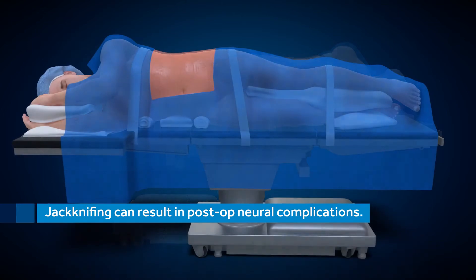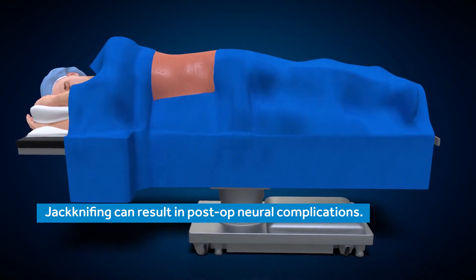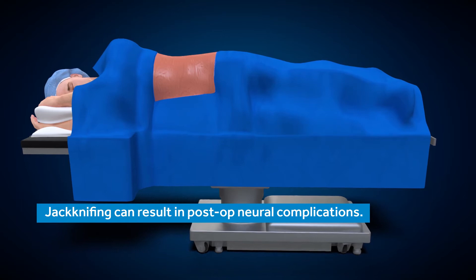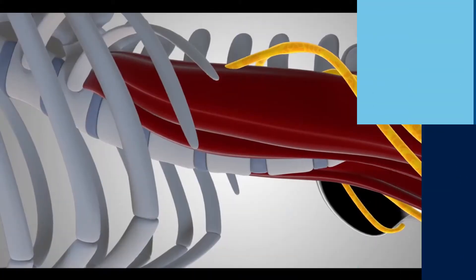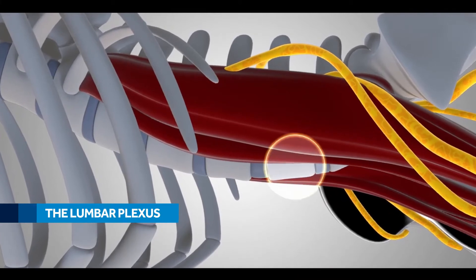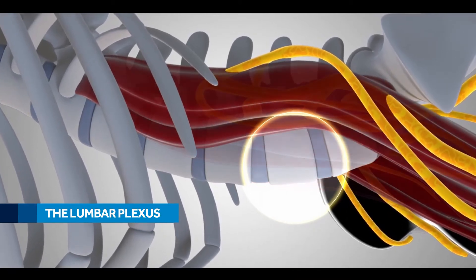OLIF procedures do not require jackknifing of the surgical table, as OLIF is performed at a trajectory outside the anterior portion of the psoas muscle. This trajectory is also away from the nerves of the posterior aspect of the psoas.